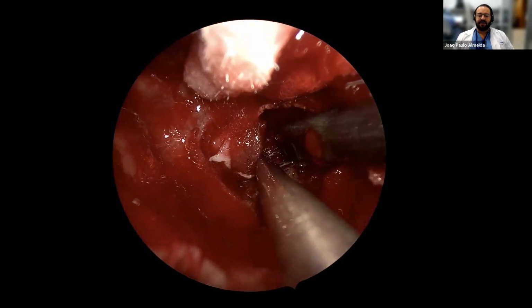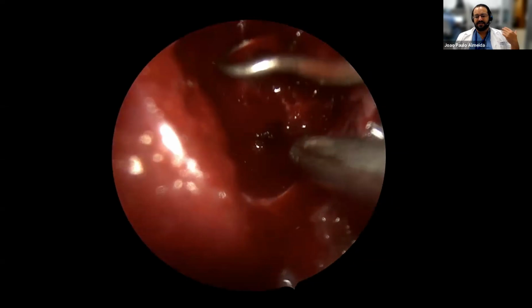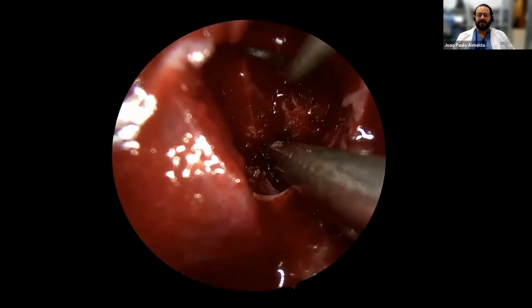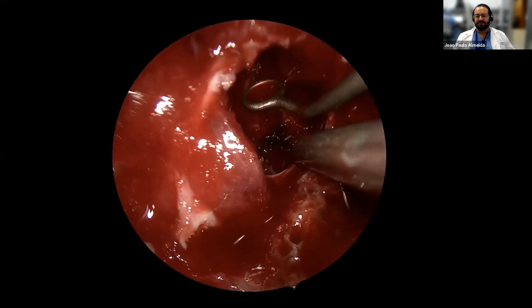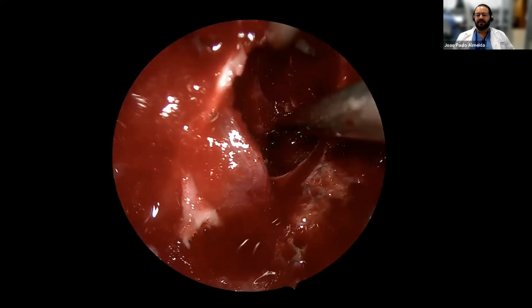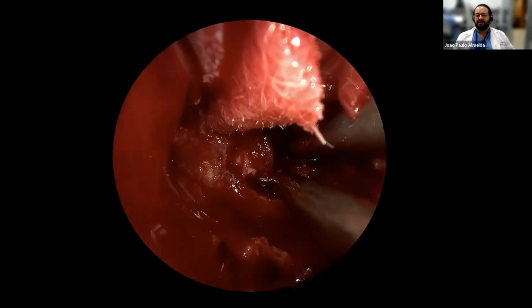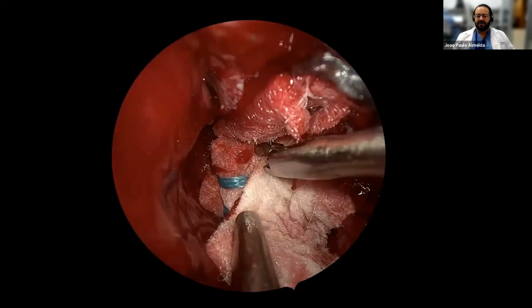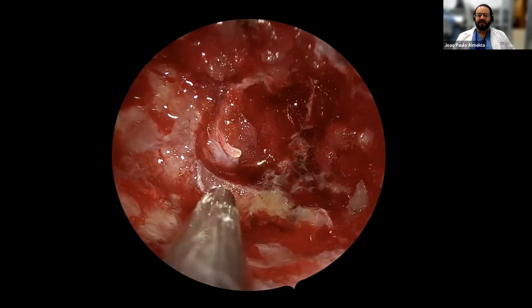And then I decided, okay, I'm going to have to do a selective resection. The most posterior part of the medial wall was left, the one close to the inferior hypophyseal, because I didn't feel that I had good control, and we felt that there was no tumor there. So I just decided to coagulate, as you see there in black, and then clean as much as possible to the top and to the roof to make sure that we wouldn't leave anything above the carotid. I think after that we got this nice control, hemostasis, and then we went ahead with the closure.